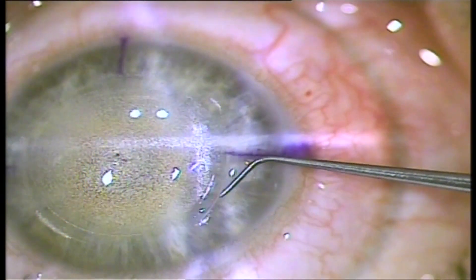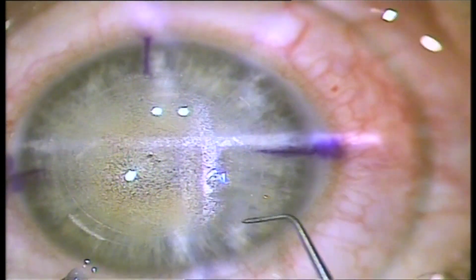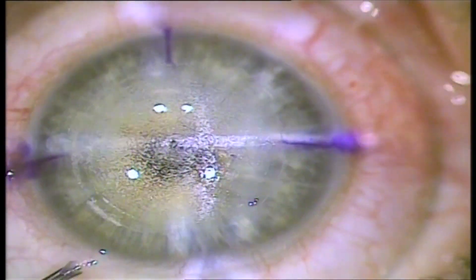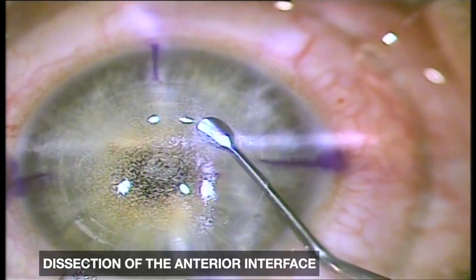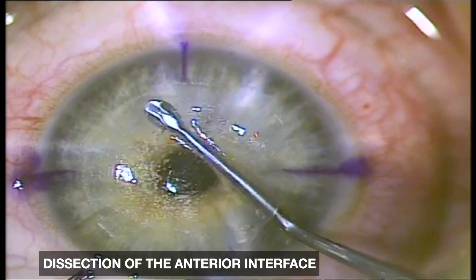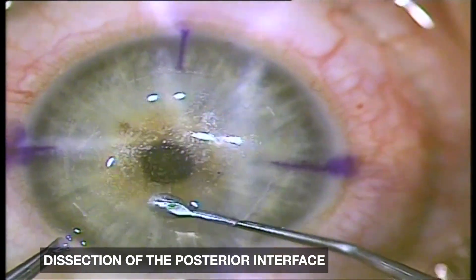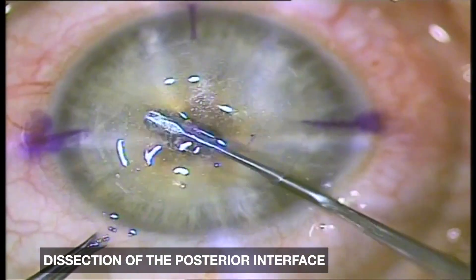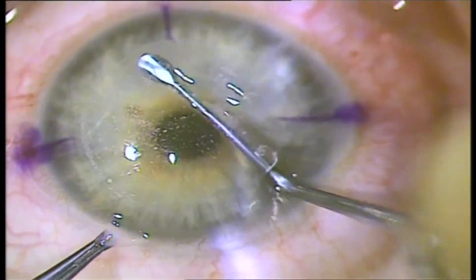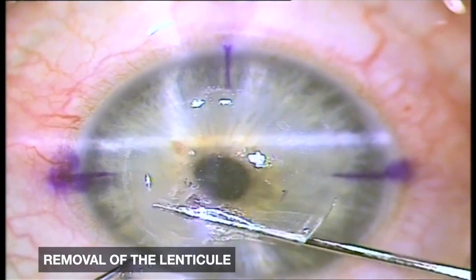More advanced surgeons might elect to create the second incision and keep it unopened as a safety net, as can be seen in this second procedure, while they dissect half of the tunnel anteriorly and the other half posteriorly, and proceed to dissect the anterior interface first, then the posterior interface.